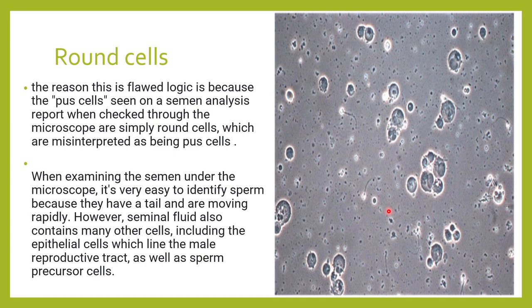Sometimes all these round cells are thought to be pus cells and are misinterpreted as pus cells. When we see under the microscope, we are very much able to identify a spermatozoa by its tail and its head. But there are many other cells in the background — precursor cells, pus cells, germ cells, RBCs — and it is a little difficult to identify those.